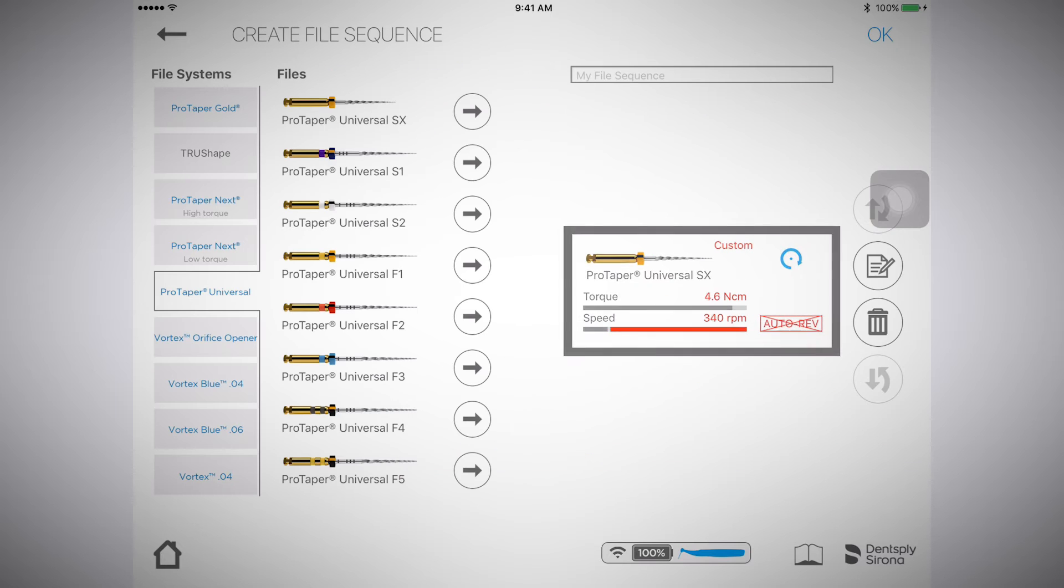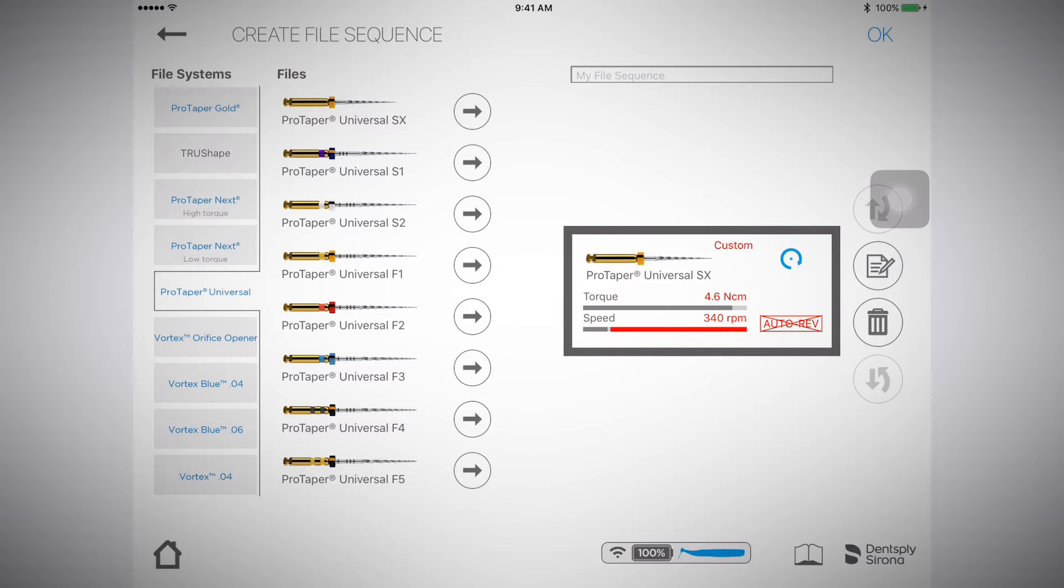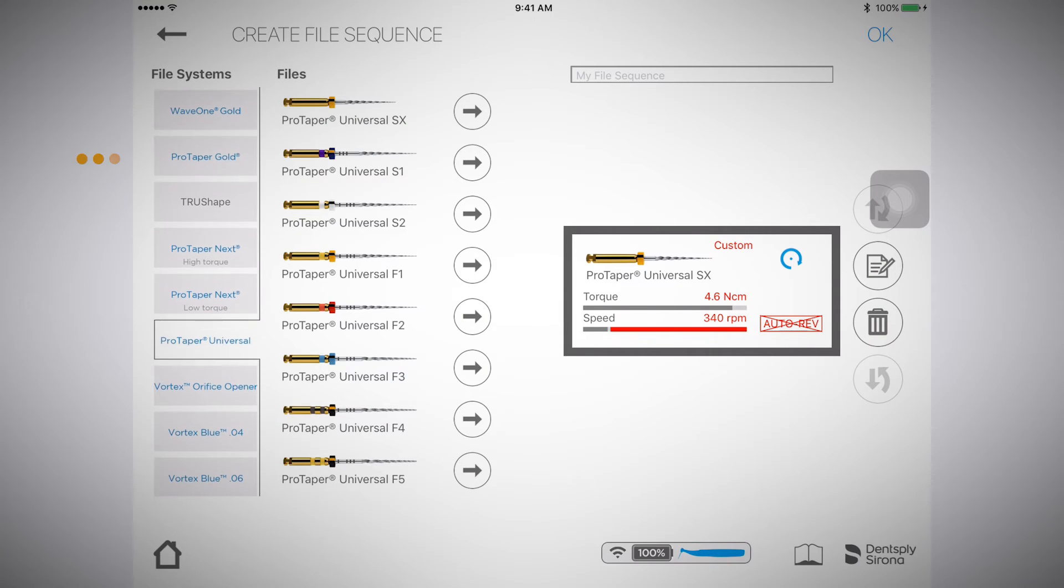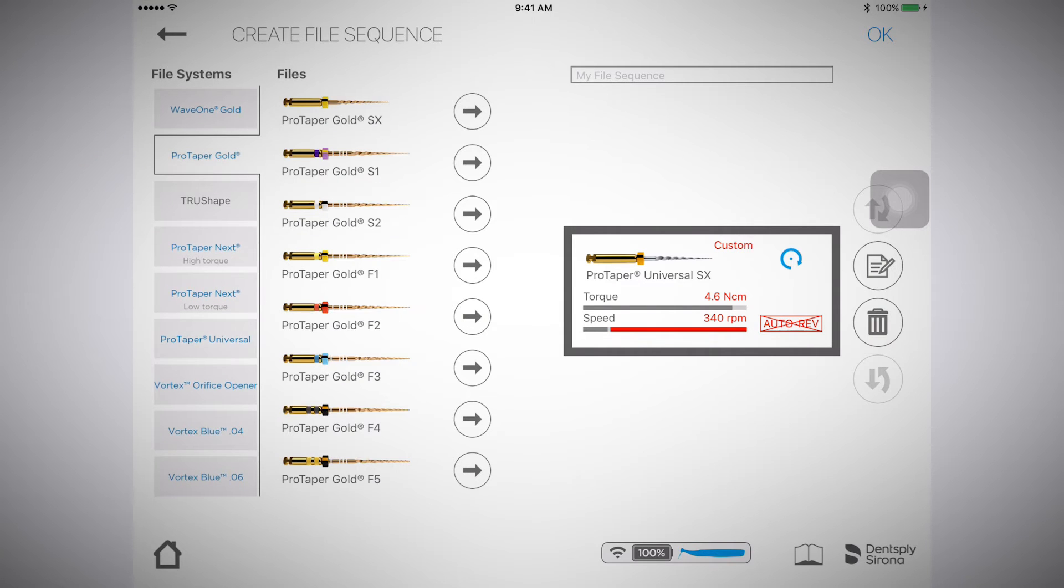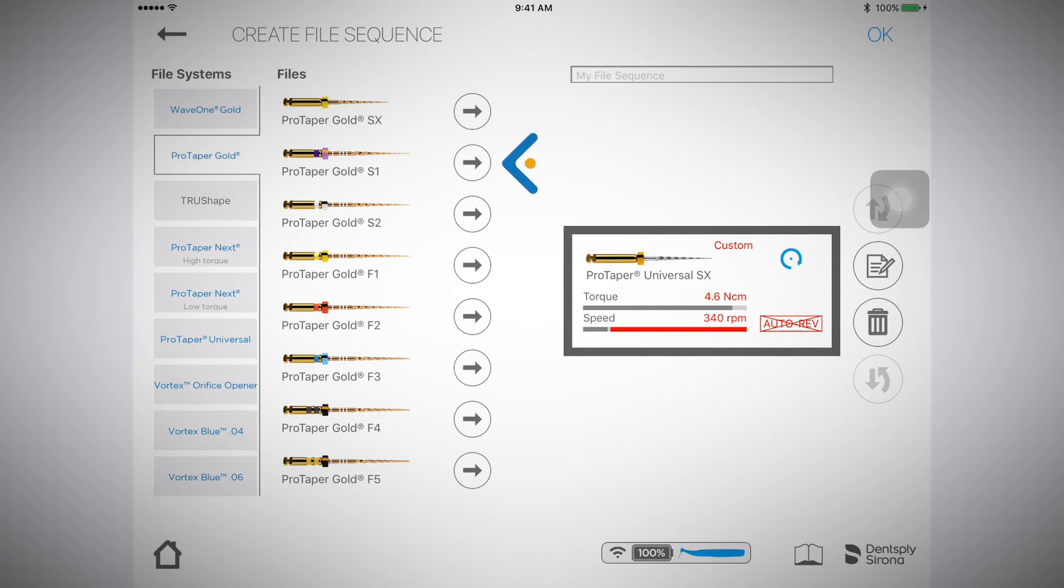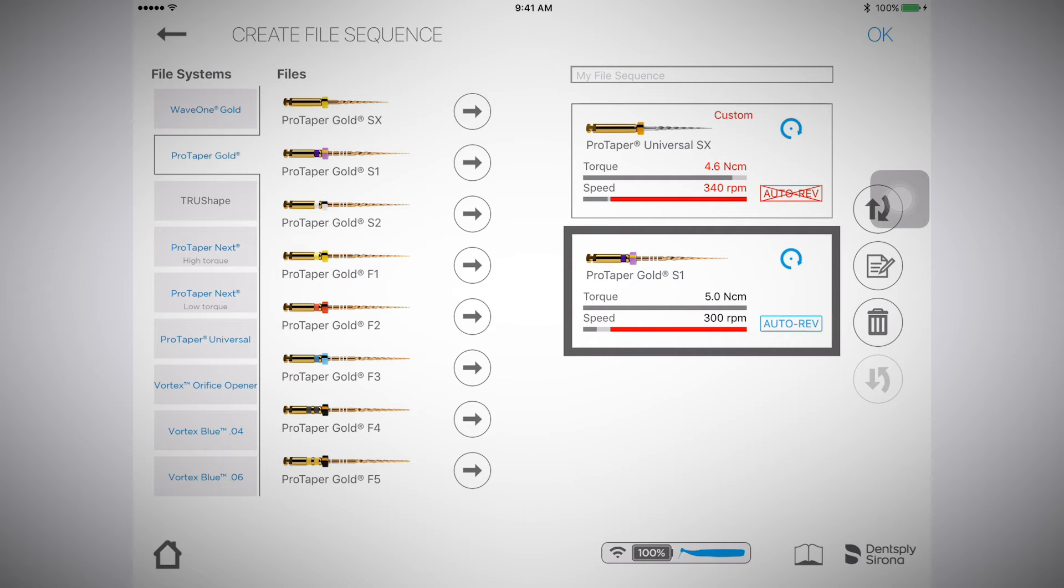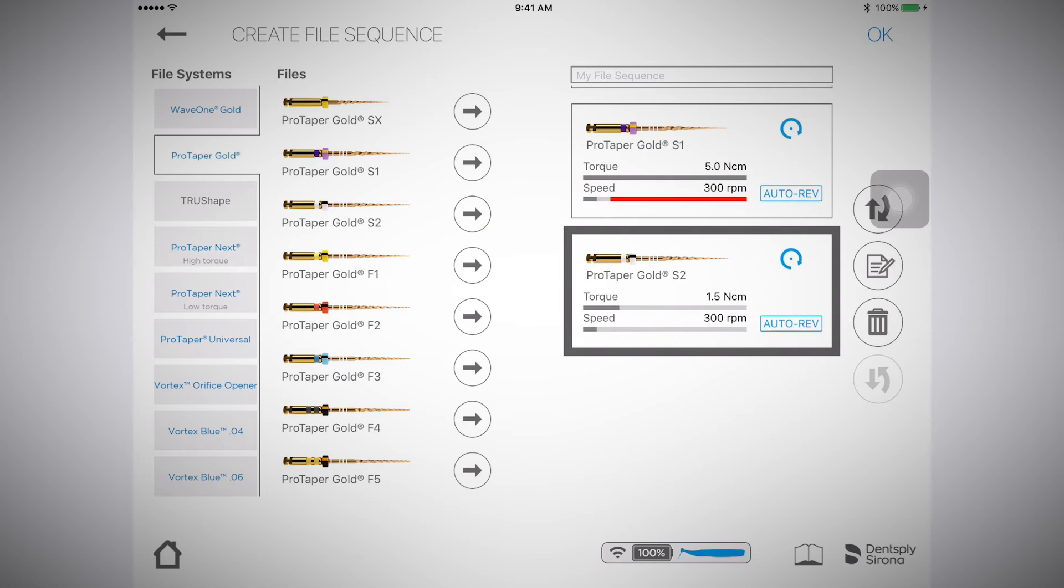The next file I would like to add to my sequence is the ProTaper Gold Shaper 1 file. I'll scroll up to the ProTaper Gold file system. I will add the S1 file by selecting the arrow button to bring the file over the sequence. I am then going to add S2 by selecting the arrow button to bring it over to my custom file sequence.